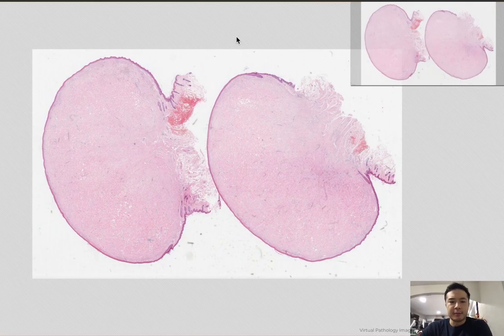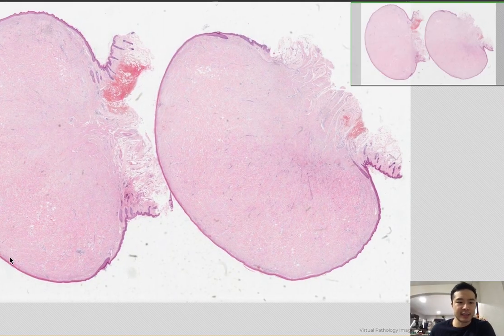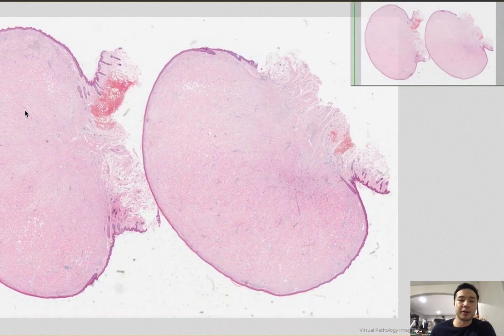Today we're going to talk about keloids. Keloids can be very concerning cosmetically, especially on the earlobe and when it's enlarged. Thank you to Virtual Pathology at the University of Leeds for this online slide. Look how big this is. This represents 2 millimeters, so approximately like 1 centimeter on your earlobe. That can be very concerning, especially when it's a site where people can visually see it.